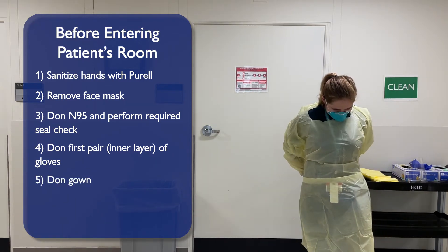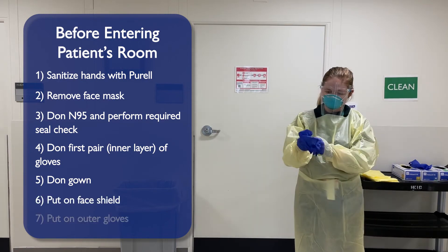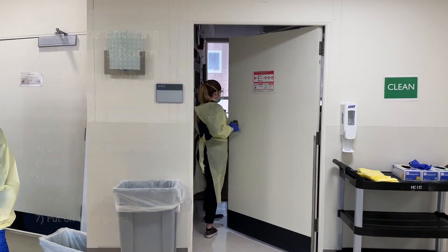Don your gown, ensuring it is tied. Next, put on your face shield. Finally, put on your outer gloves. You are now ready to enter the patient's room.